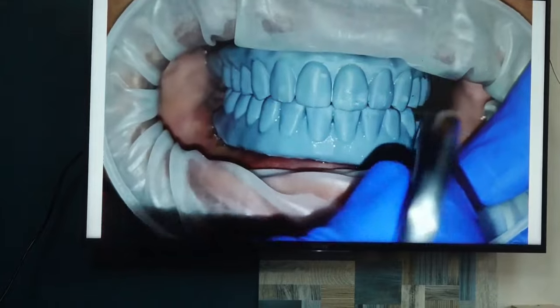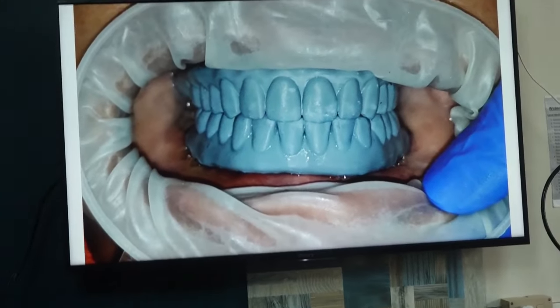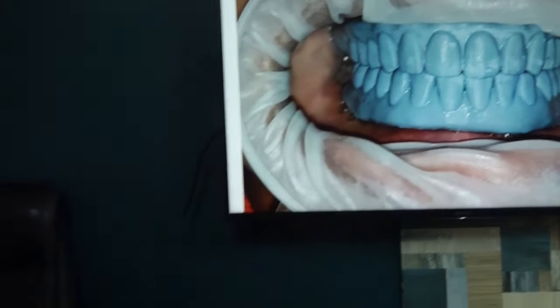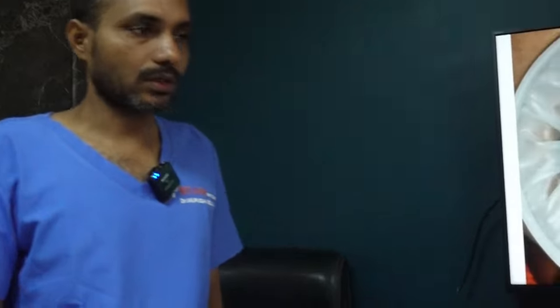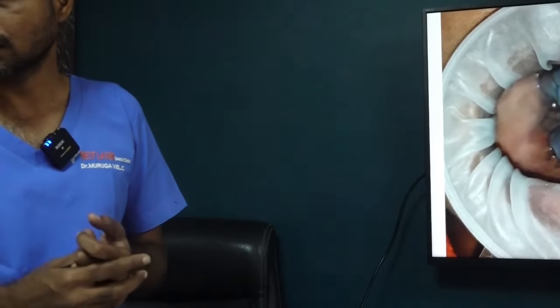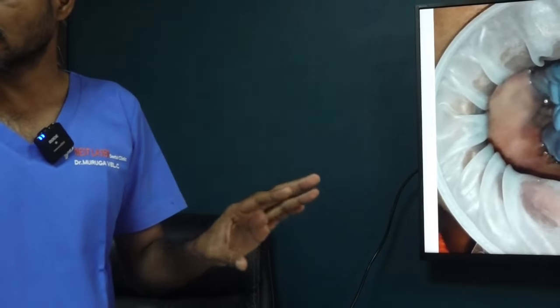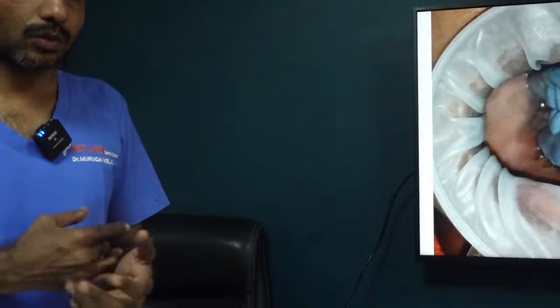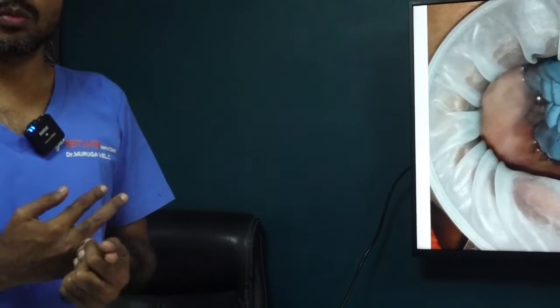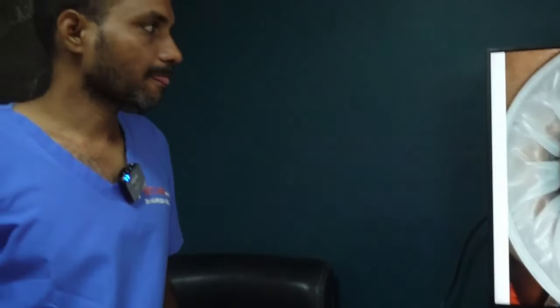Okay. If you have taken impression model and if you do the scanning, because there are some doctors, they do like that. They do the impression and they will pour model and they will give it to the lab. They will do the scanning and all. That the accuracy won't be that much good, so you have to spend some time in bringing the fitting. So it is almost 100% a digital protocol only. There are no impressions we are taking, no models, no articulations. Okay. Next.